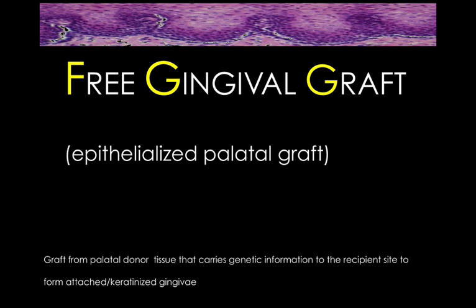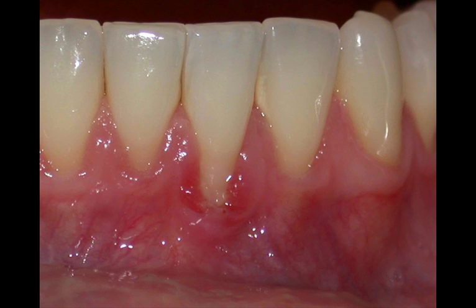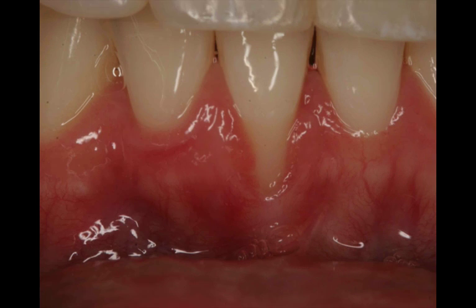So I wanted to show you some of the main indications for this procedure, which is usually lower incisor teeth. I'd like to say 90-95% of my free gingival grafts are in this area. And typically, these are relatively young patients with recession, with poor tissue quality, no attached or no keratinized tissue, and sometimes also a frenum pull. And they really work great in this area.